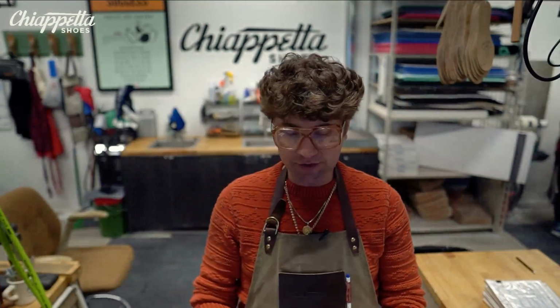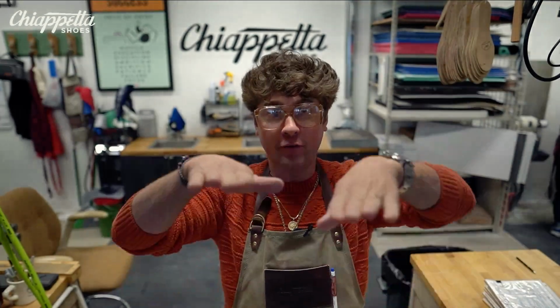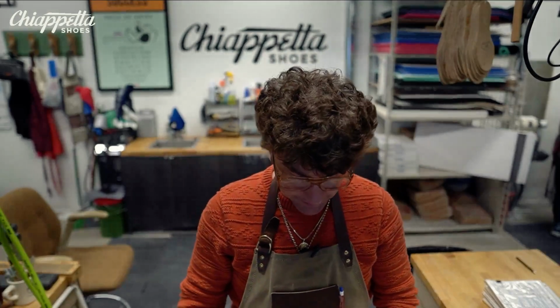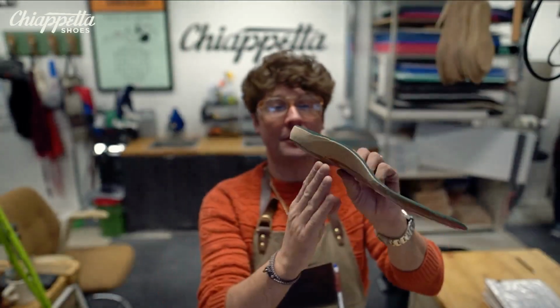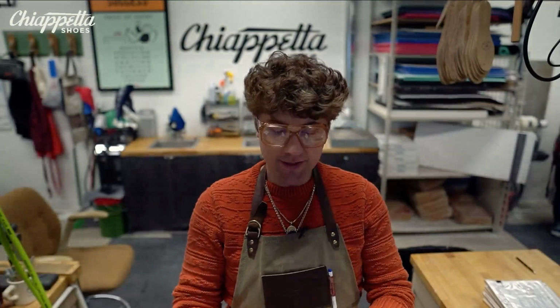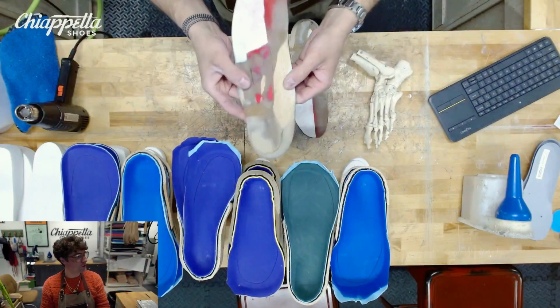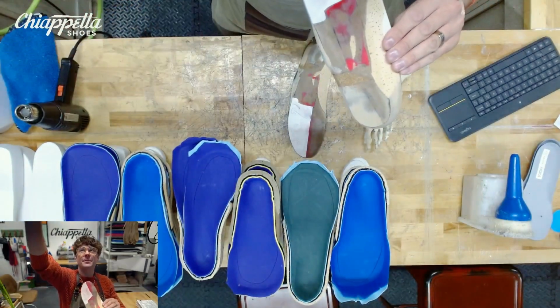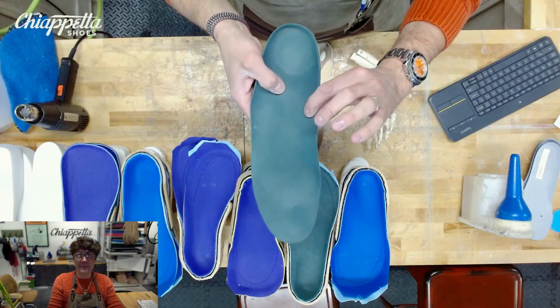So we're kind of starting fresh. I'm still keeping the lateral forefoot wedge as a corrective or accommodative measure. The forefoot has a 5 to 10 degree forefoot valgus, so we're filling up the outside, keeping him nice and even off the big toe. We scooped out this medial arch. Now I'm going to fill that up with a 45 durometer EVA. That 45 durometer EVA is softer. This cork right here is a 55 durometer multi-cork. So we're filling it up a little bit differently, and it's still going to give you the contour, but not be nearly as firm underneath that medial arch.